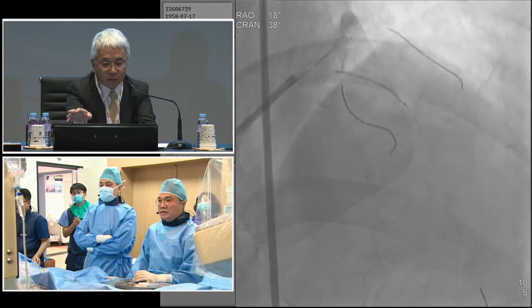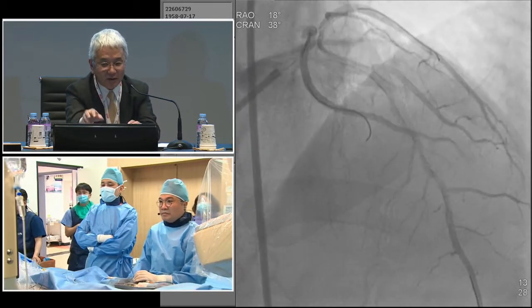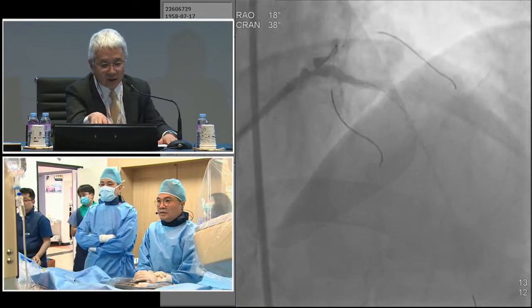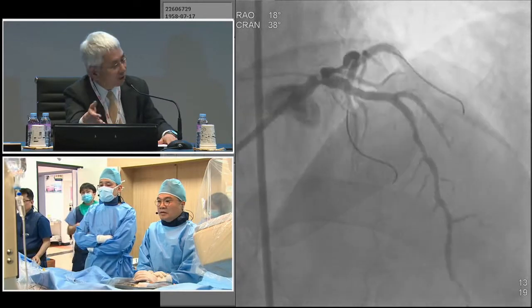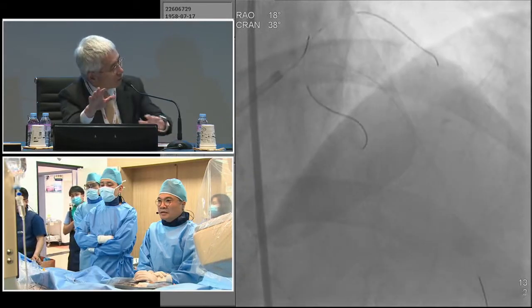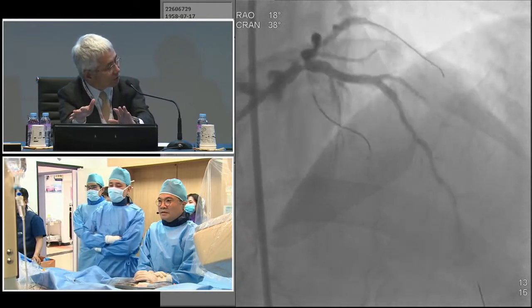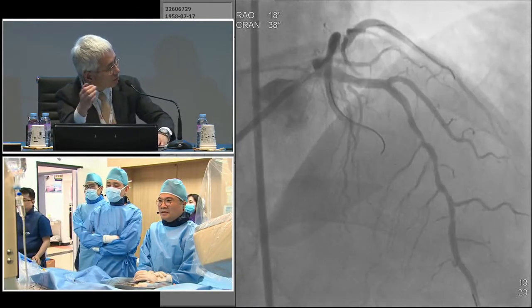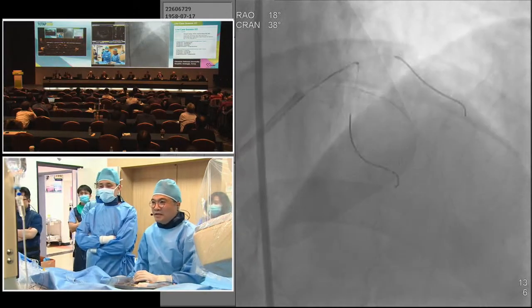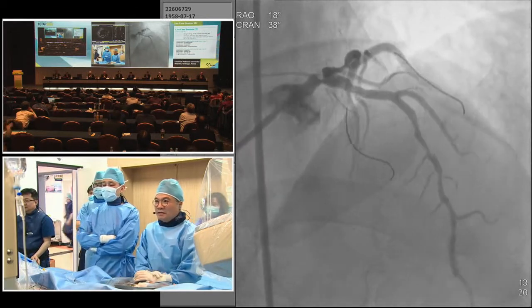So if you implant stenting, many kinds of stents would be implanted. Compared to bypass surgery, this is the final result; I cannot make a better final image. So I sometimes choose to send such cases to the surgery team. But actually, the LV function, I think, is not so bad, so maybe we can try PCI also.